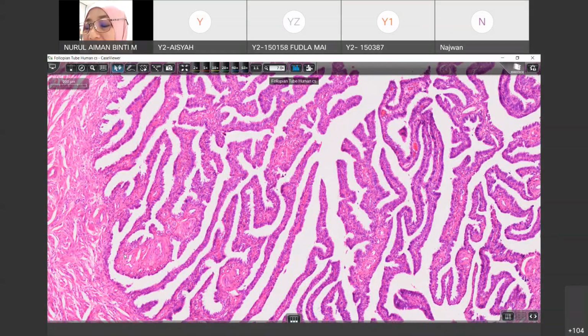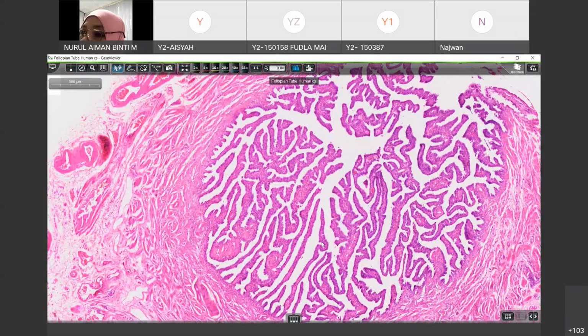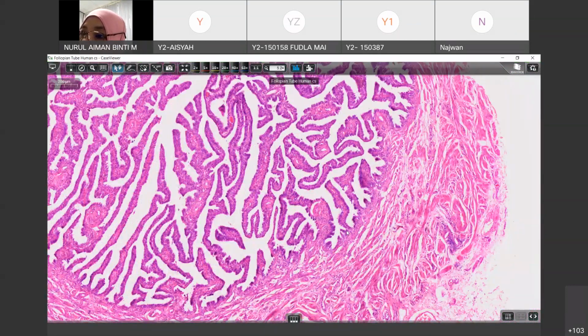Let's say I ask you about the ovary, the next thing I should ask is another slide you have to identify, which must be either uterine tubes, uterus, or follicular phase, or menstrual phase. Usually you will get 2 slides from the same lecture. Okay, so it's quite hard to find the region.